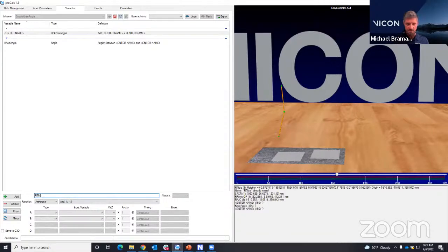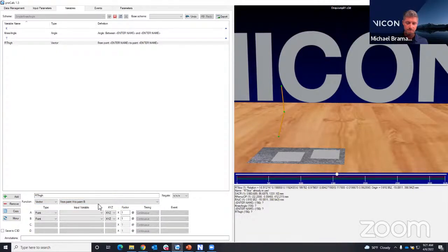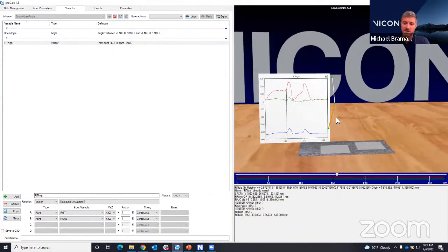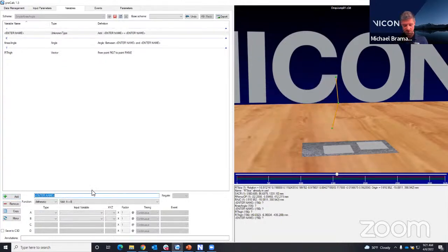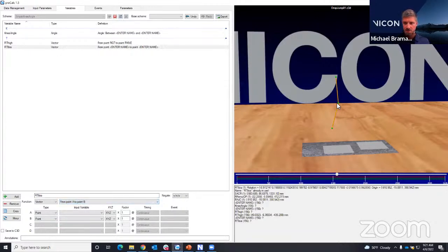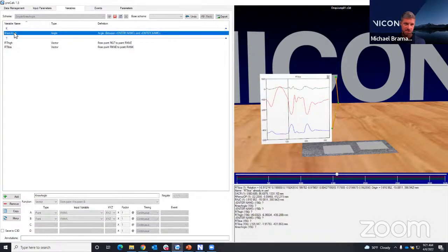And I'm just going to create a right thigh vector. So change the function to vector, and then I'm just going to define it as point A to B. And the great thing is I can just click on the markers in the 3D workspace. It's helpful to know marker labels, but I know I have the right one just by choosing them in the workspace. So there's my right thigh vector. I've also got the right tibia that I'll create, and do the same thing, my knee to my ankle. All right, and I've got those two vectors created.